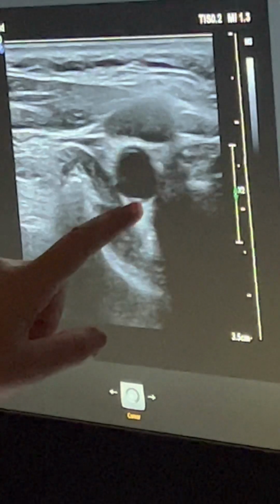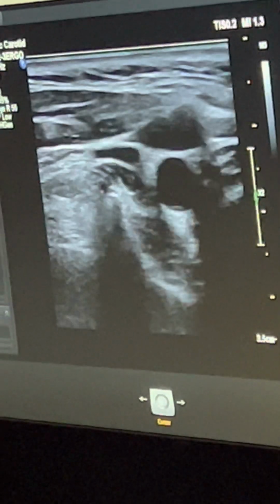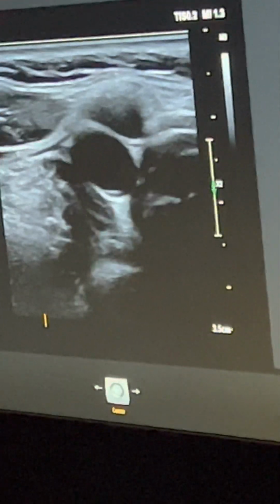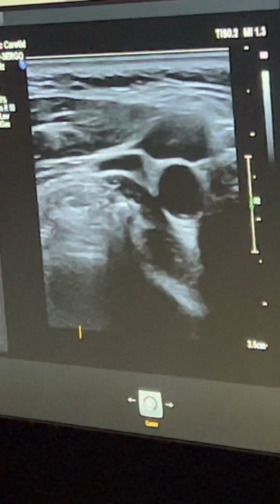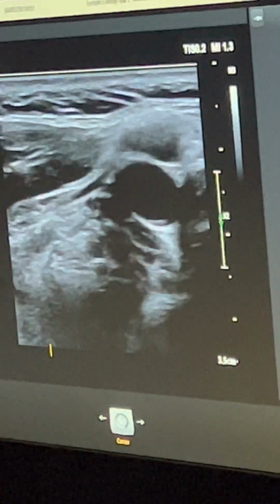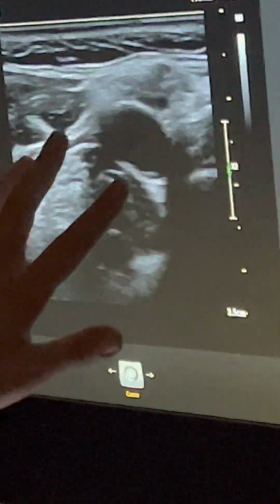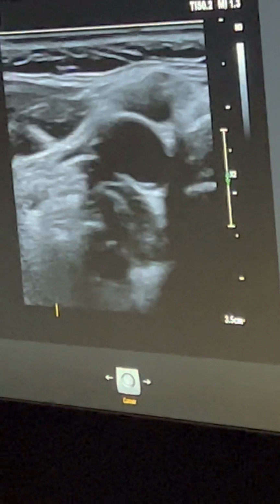Think of it like when you were doing your distal aorta. You went down till you could see the bifurcation, and then you just went back up just a little bit superior. That was your distal. Think of that like you're doing this. So you're going into before the bulb and then moving backwards. Okay. So now we're going to go just a bit more superiorly, and where it's oblong, widened that way, that's the bulb.